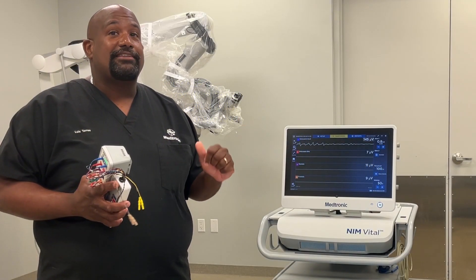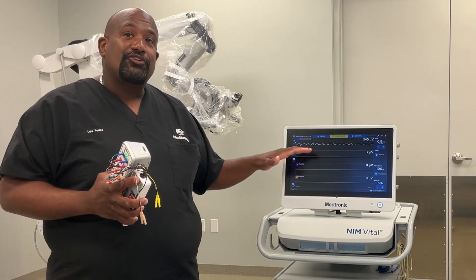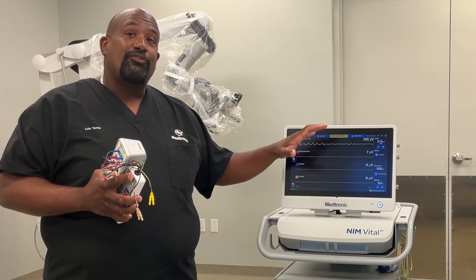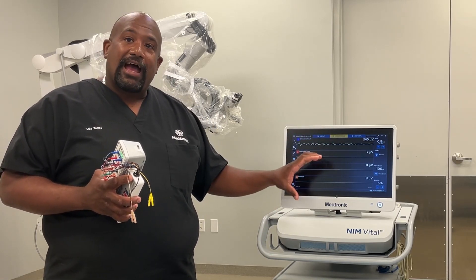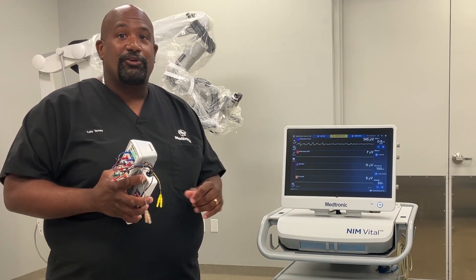The NIMH will mute anytime you're using monopolar electrocautery. You'll get a warning on the screen that says 'Warning: monitoring is disabled, muting from external source.' And every 30 seconds afterwards, it will give you a tone or an alarm to let you know that it's muting.